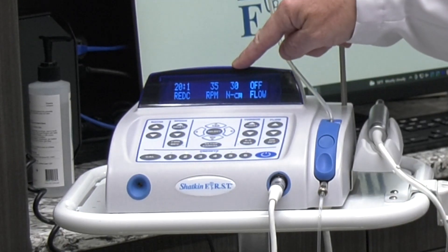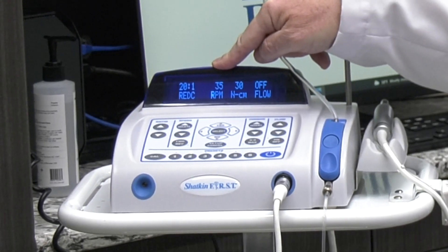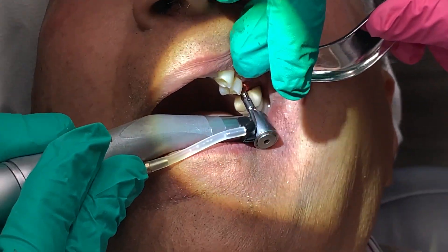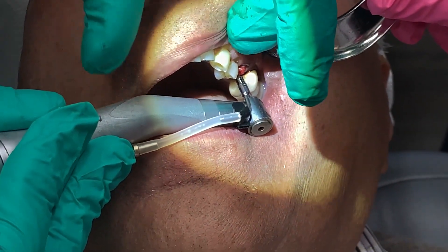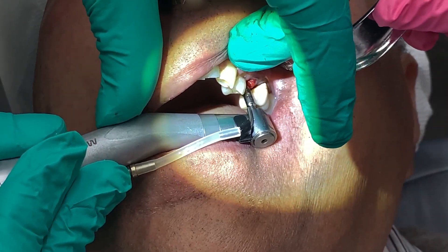This motor is set to 30 newton centimeters of torque at 35 RPMs. So you're going to go ahead and place the implant through that pilot hole with the motor until you hear the beeping sound of 30 newton centimeters of torque. Once you get to 30 newton centimeters, you know you've got enough torque resistance to load that implant immediately.